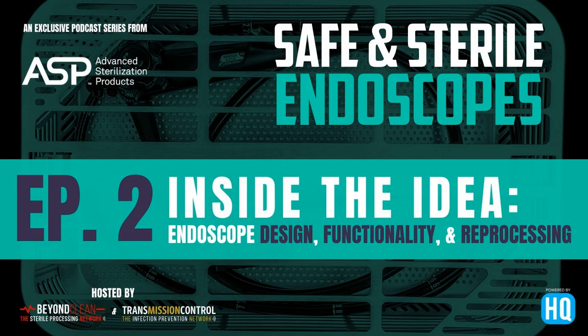We look at 3 different models that we're working on currently: a centralized model in GI only, a decentralized model where GI starts the process and then sends it down to SPD to be completed, and then a centralized process outside of GI, i.e. in the SPD. I was just at a facility in Alabama yesterday that they are centralized in SPD for the entire facility. So when we think about that workflow, they're already used to processing GI scopes, making sure that they're dried properly, and then they're sent back up for hanging in the scope cabinets ready for the next patient use.